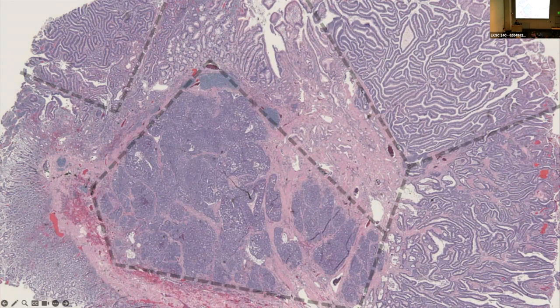We'll be covering a couple of them actually in the histology session later. There are giant lists of artifacts that you can get for IHC specifically. You can get edge artifacts on the edges of tissue, maybe because there's differential fixation, so those areas can be slightly different. Necrotic areas can bind antibodies non-specifically, and so you get a lot of false signal where you get necrosis.